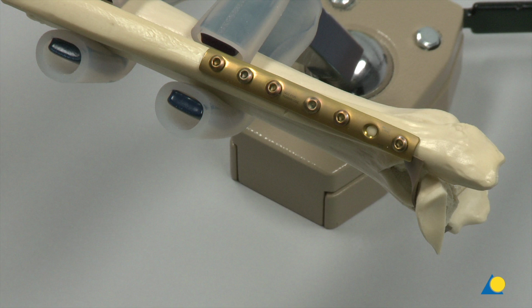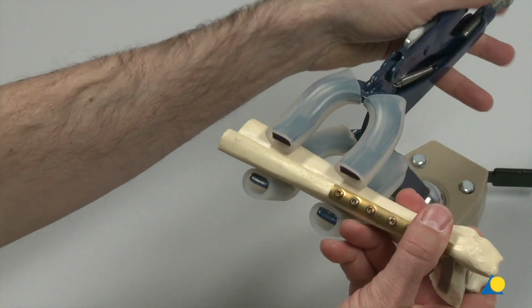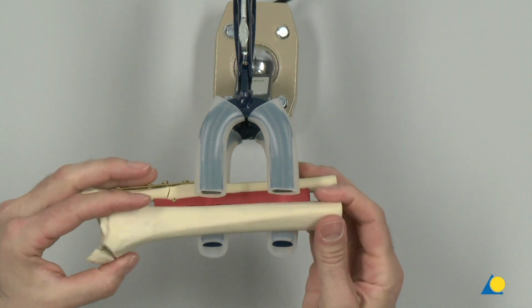All the remaining plate holes are filled, except for the second distal hole, which will be used later for the position screw. To facilitate access to the medial malleolus, the bone model is released from the clamp and rotated 180 degrees.